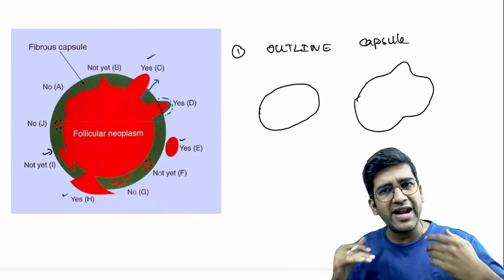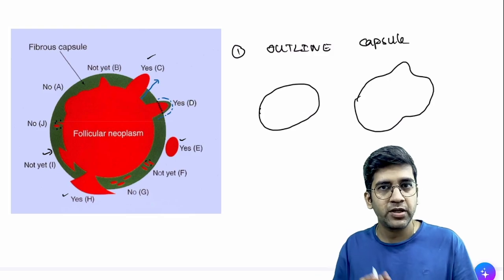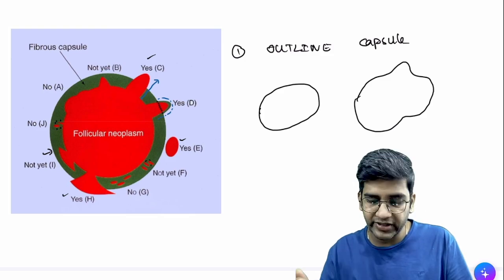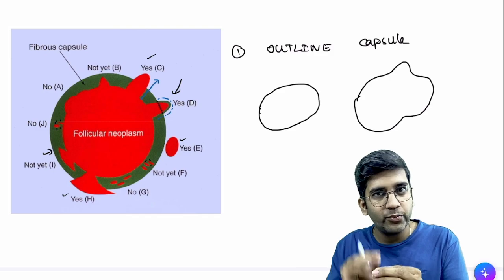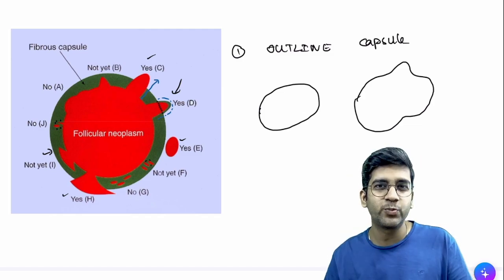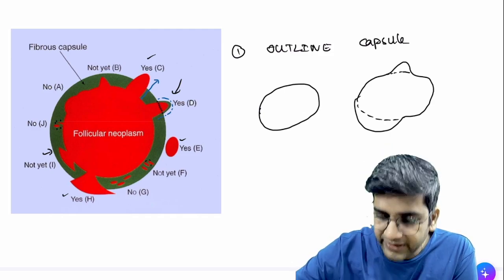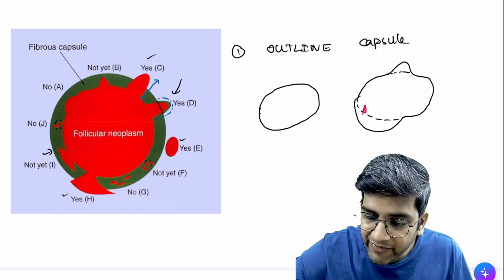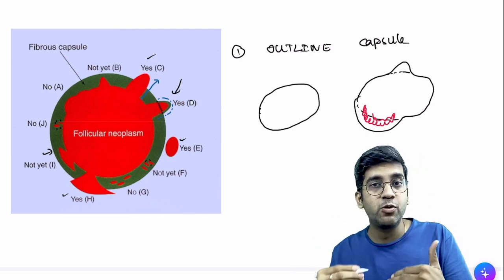If the capsule is irregular, by default it is invaded — keep that in mind. The reason I stress this: whenever there is an invading front, it will produce a desmoplastic reaction. Desmoplasia — the fibrosis and collagen — looks the same as the capsule. Ideally the capsule should follow normal architecture, but when a tumor grows here and destroys the capsule, it creates desmoplasia that merges with the surrounding capsule.